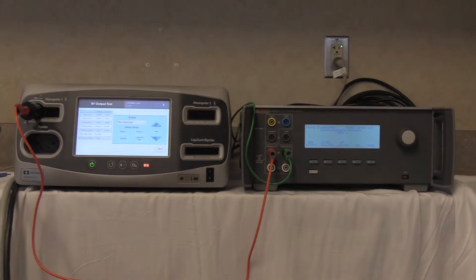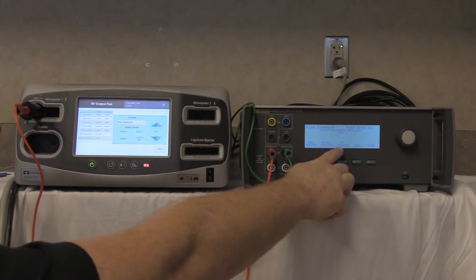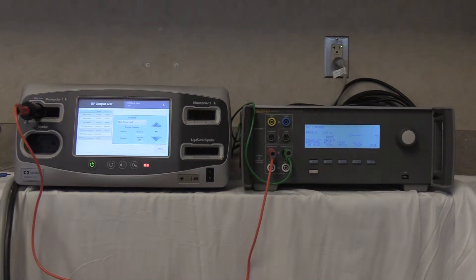The procedure asks that you set a 200 ohm load. To do that, press the high frequency leakage button F3 on the QAES-3, which automatically installs a 200 ohm load.